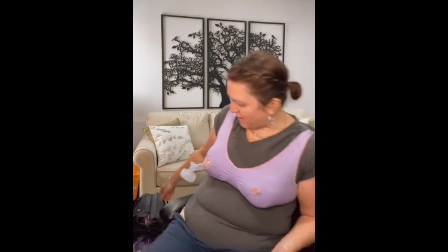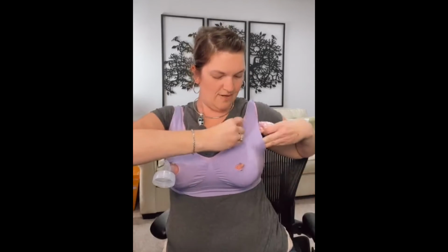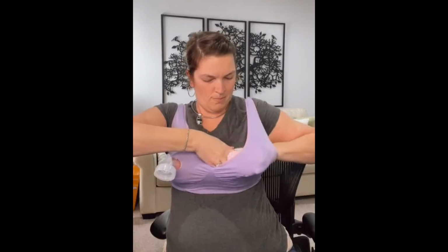I don't know if I have a nursing pad. I've got one over here. Hold on that thought. I got everything in my drawers. Take your nursing pad and bada bing, bada boom.